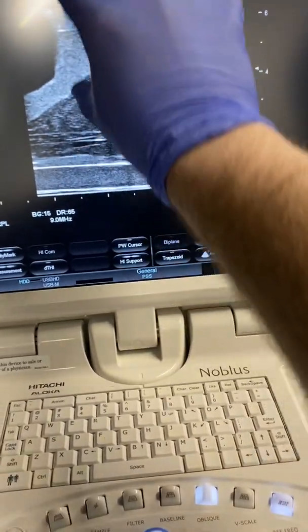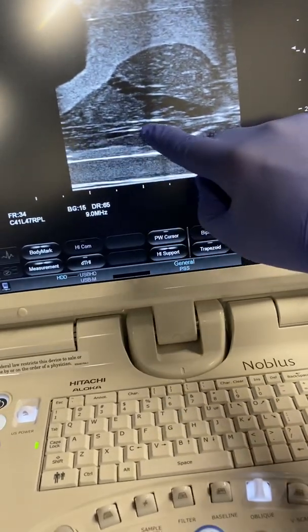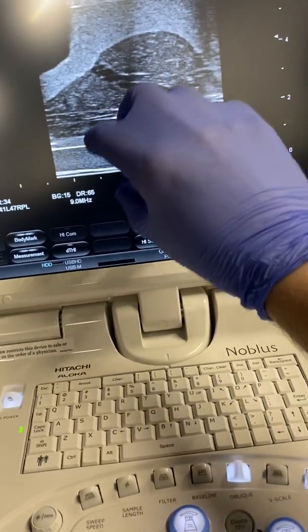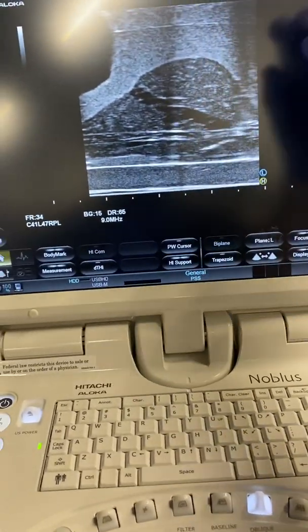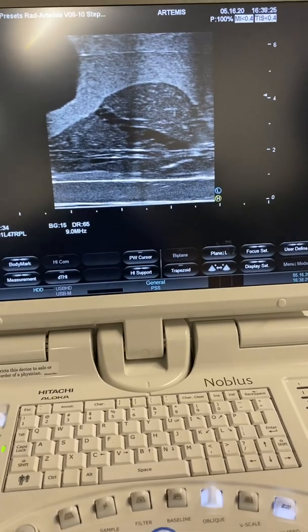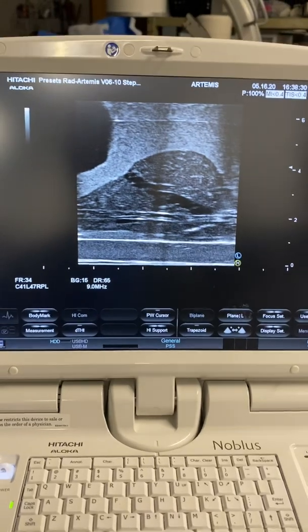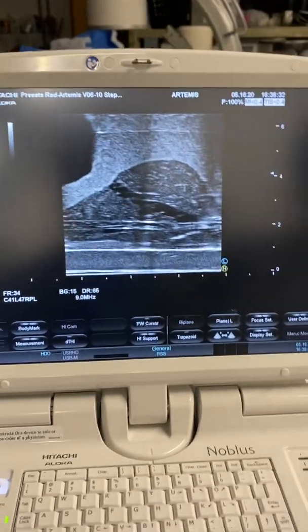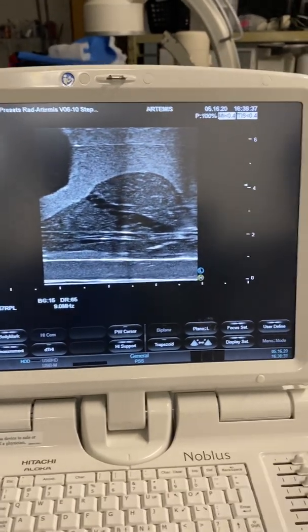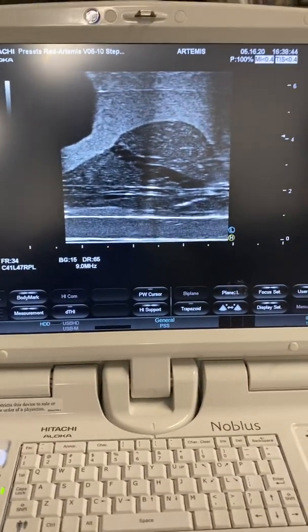The gel will push the prostate away from the rectum. When it's deployed, you'll see a large amount of hardened, gelatinous material that creates a cushion for the prostate. That way, once they're radiating the prostate, the rectum won't be exposed to radiation. It's been shown to really reduce side effects, the biggest being colonic toxicity - radiation hitting the colon causes poor quality of life for the patient.